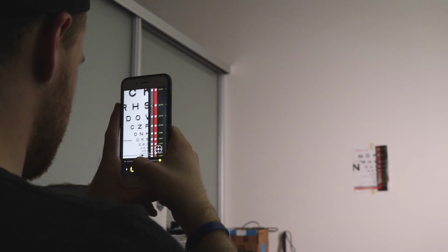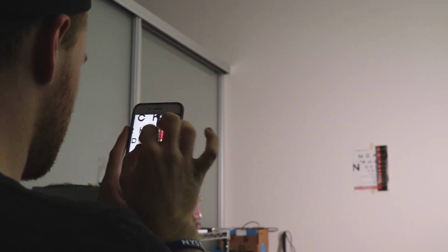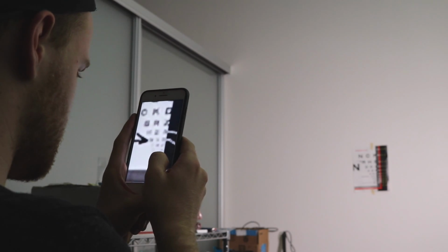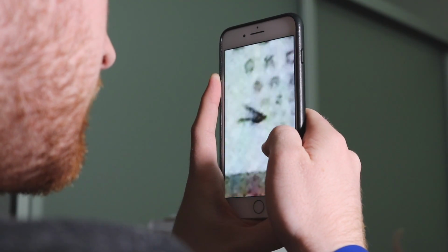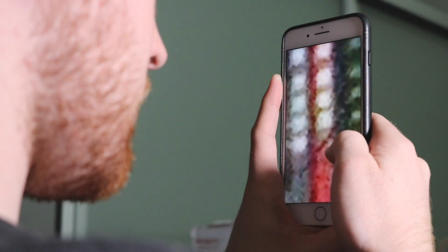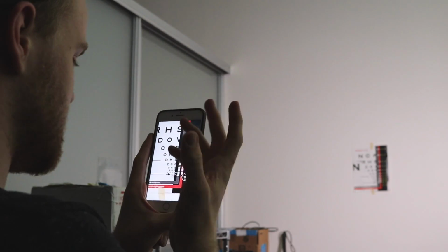What else you can do though is you can take a little snapshot. It will try to take the best focus as possible. You can't actually save it unless you screenshot this, but from here you can just zoom in. Very pixelated at this point, but again, just being able to zoom in from this distance, turn what is something as small as this into actually readable, is pretty incredible.